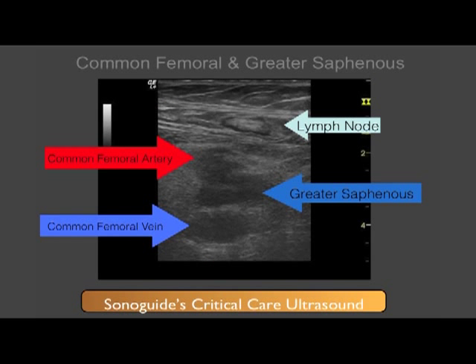Here is the actual acquired ultrasound image from this patient. You will notice from deep to superficial: the common femoral vein, the greater saphenous vein as it is branching off the common femoral, and the common femoral artery. In the most superficial portion, you will also notice an incidental finding of a lymph node.